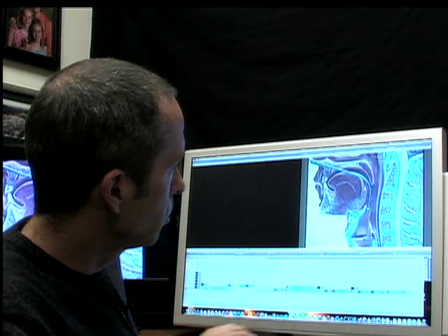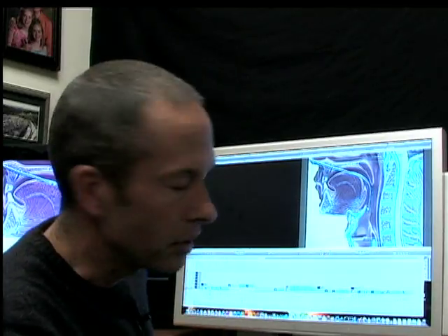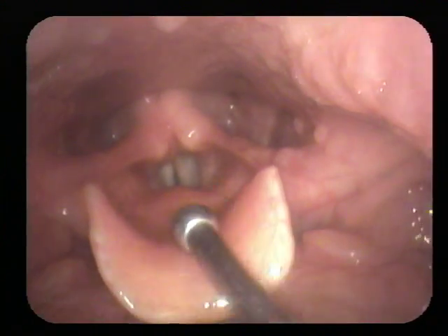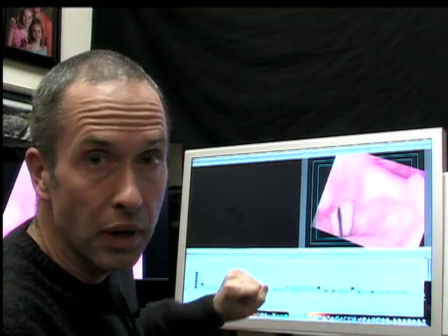When this lands on the vocal cords, the patient is going to gag the first time. I put about a cc in first, and then as the patient starts to get anesthetized, I put a second one in. What I'm looking for is what's called a laryngeal gargle — the patient is saying 'ee,' and as the anesthetic drips on the vocal cords, we hear it bubble around and coat the whole voice box.